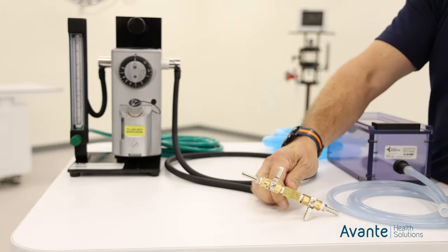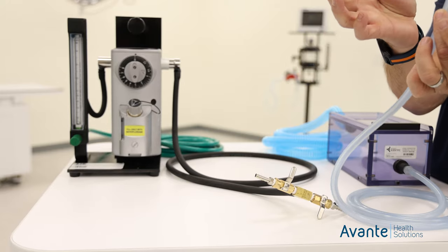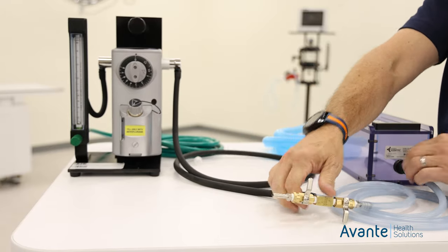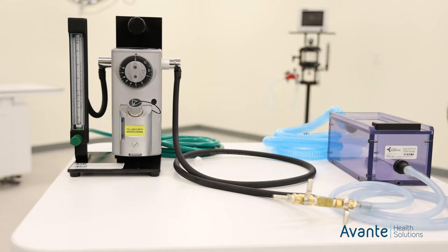What we'll do here is take the provided tubing that comes with the induction chamber and take off one end of the fittings. Simply slide that end over. The other end goes to our induction chamber, and then we're ready to induce.